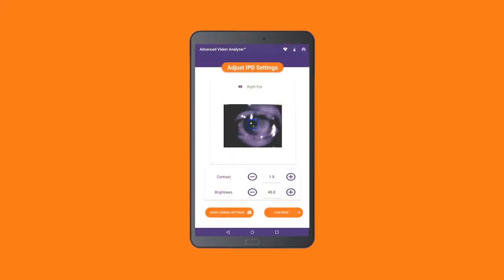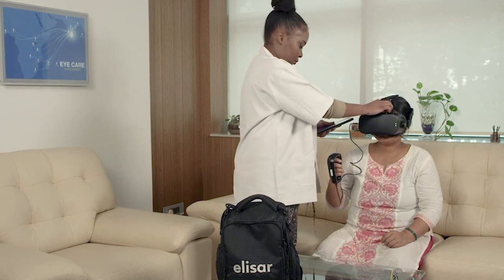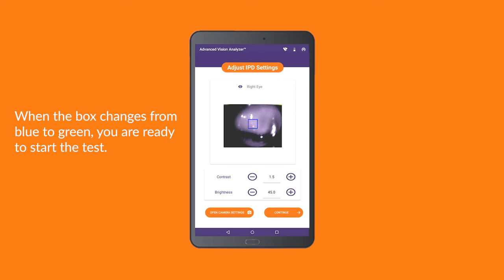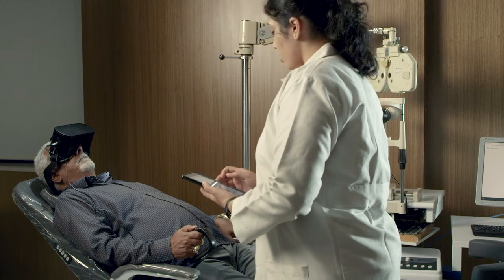The last thing you will need to do before you can start the test is the interpupillary distance, or IPD adjustment. During the alignment of the fixation marker with the screen center, the patient will observe two white dots at the center, one below the other. Ask the patient to look at the upper white dot, and the examiner should adjust the alignment of the patient's pupil to the center of the box using the IPD knob on the HMD by looking at the image of the patient's pupil on the tablet. When the pupil is centered, the color of the box will turn from blue to green. You are now ready to perform the test.